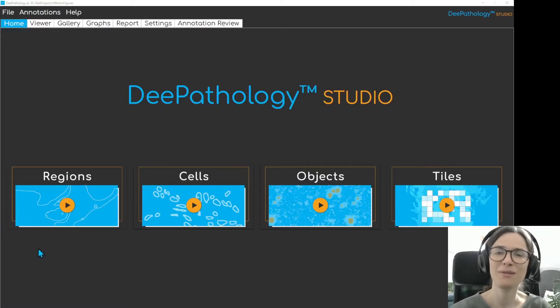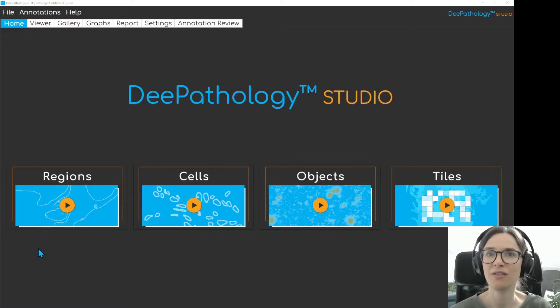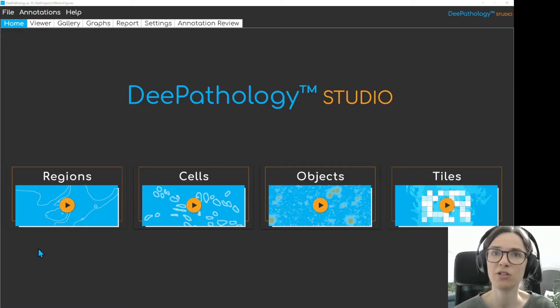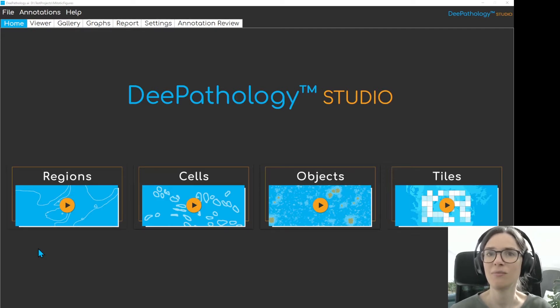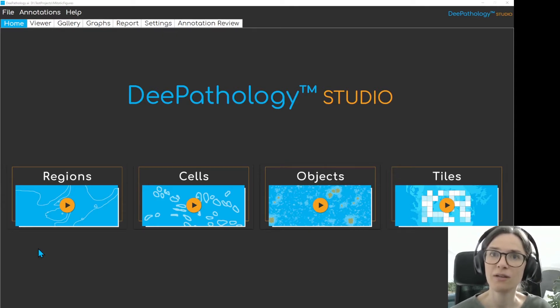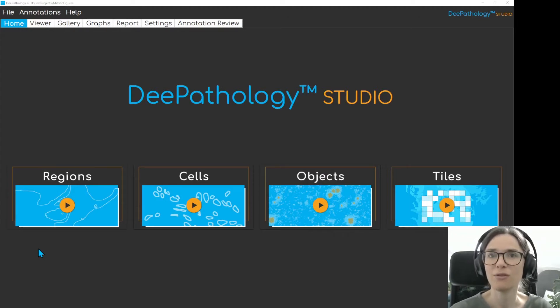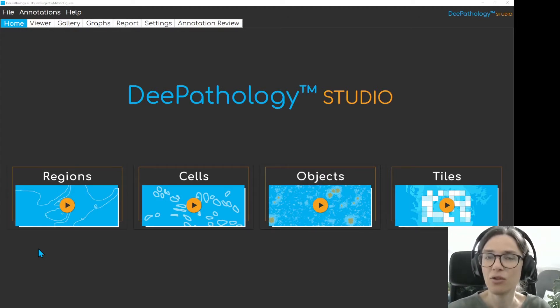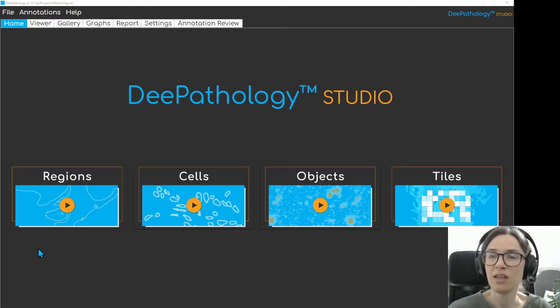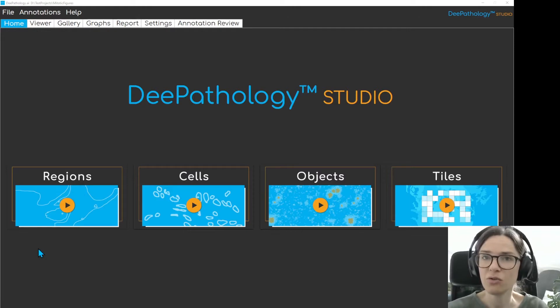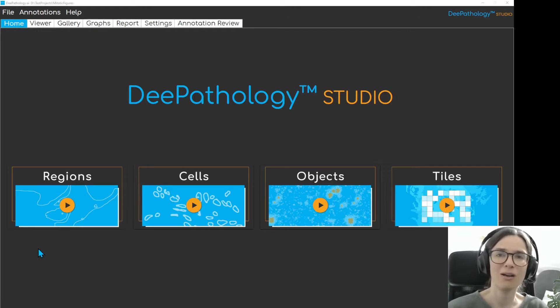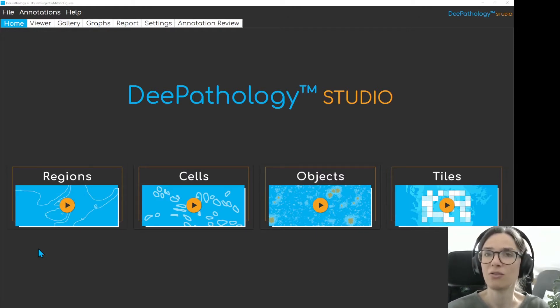Today I would like to show you how you can use the objects mode of the Deep Pathology Studio to train an algorithm to detect mitotic figures. You can use this algorithm to get the mitotic count in a region of interest on your slide. You could also train the algorithm to detect non-divided nuclei in addition to mitotic figures, so you could calculate the mitotic index or mitotic ratio, but for today's video I will focus solely on mitotic figures.